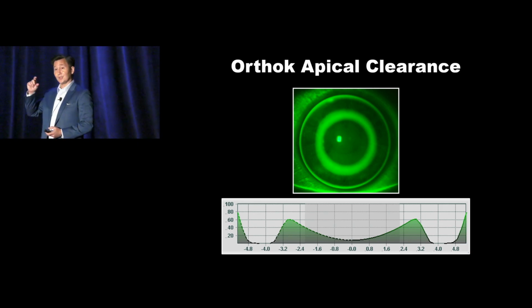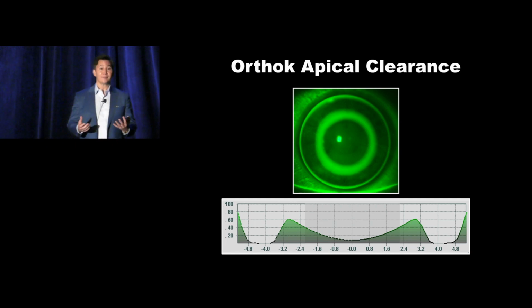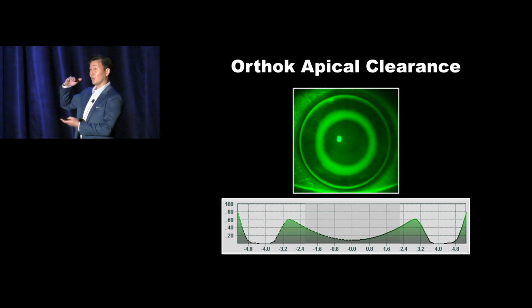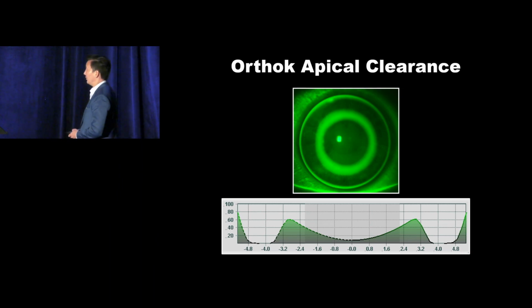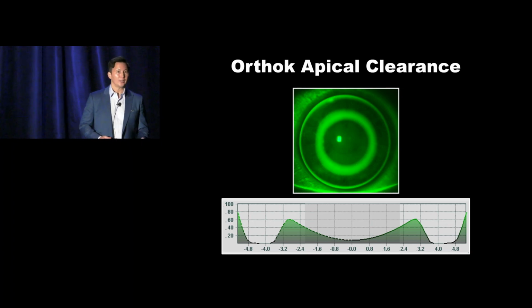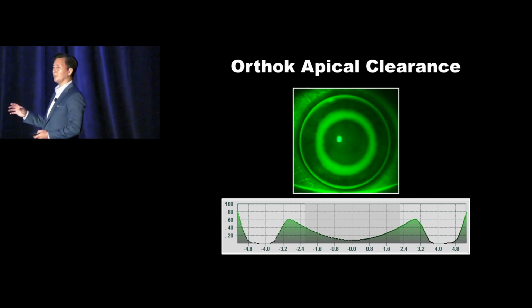We can see fluorescein at 20 microns thickness. That's where the fluorescein molecules are dense enough that we can pick them up behind the slit lamp. So if we can see fluorescein at 20 microns thickness, but a good ortho-k lens should be 5 to 10 here, how can you possibly say that the ortho-k lens is ideally clearing the central cornea? You just can't. If you look at the reservoir here, how deep does that need to be? Can you tell that it's 70 microns or 40 microns? Tough to tell. So you really can't use the fluorescein in a real meaningful way.